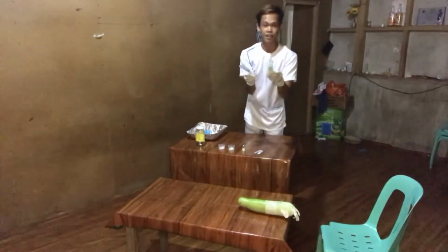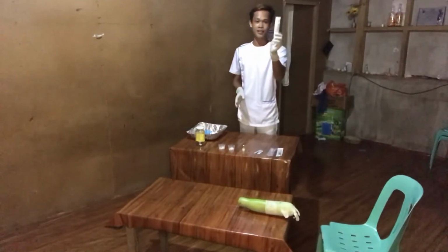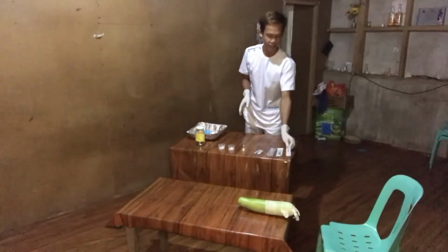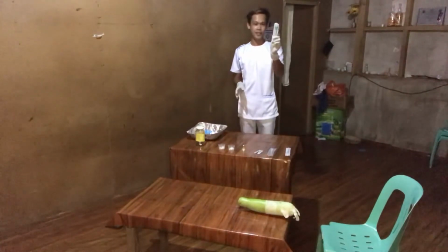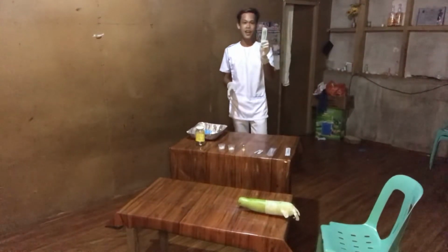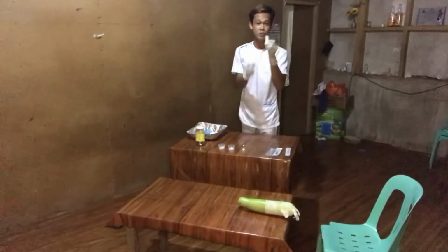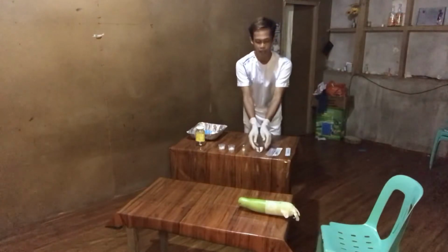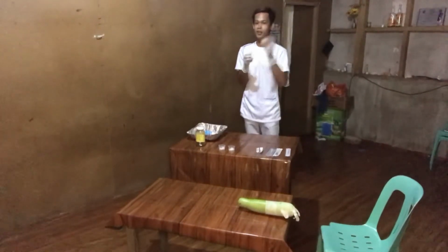These are the syringes. I have a tuberculin syringe, which is ideal for a skin test, and a 5cc syringe with a gauge 23 needle for intramuscular injections. Then we have the aspirating needles, which are used to draw the medications from the vial, and I have the ampicillin 250 mg with sterile water already.